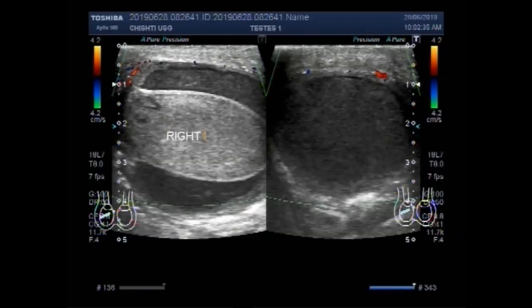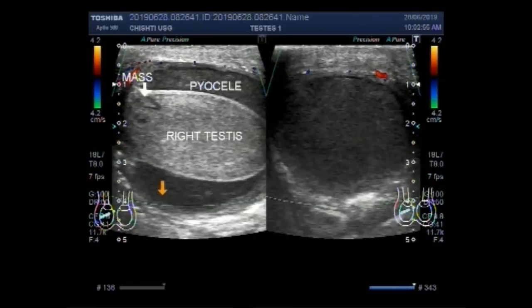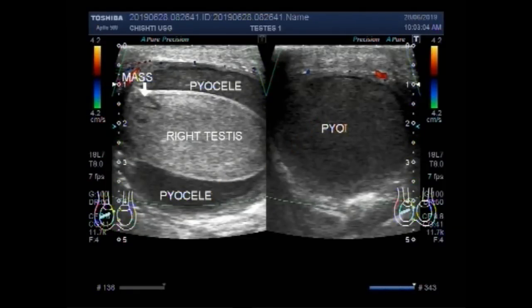I am going to label the findings: this is the right testes, this one is a mass, and this is the pyocele — a large pyocele.